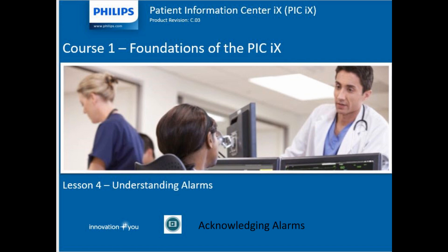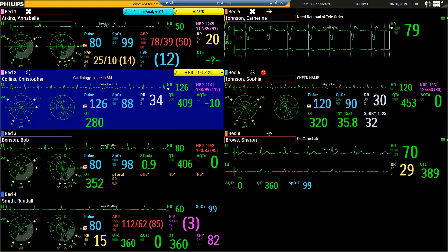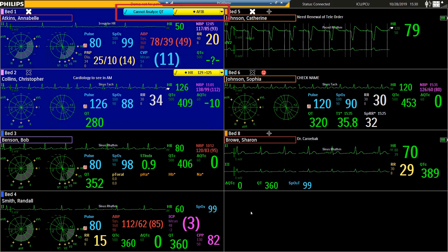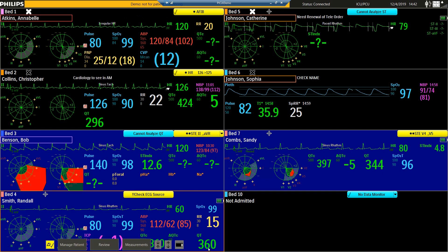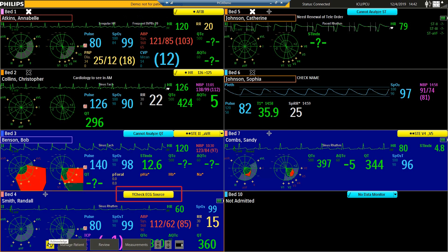Now that we've looked at the types of alarms that we may receive, let's look at how to acknowledge them. Active alarm messages will display in the alarm areas at the top of the patient sector and in the patient windows. The alarming condition will display in the banner.